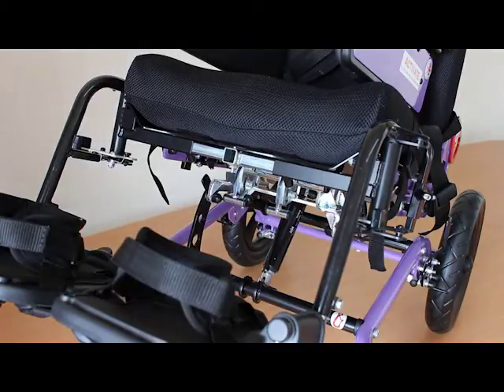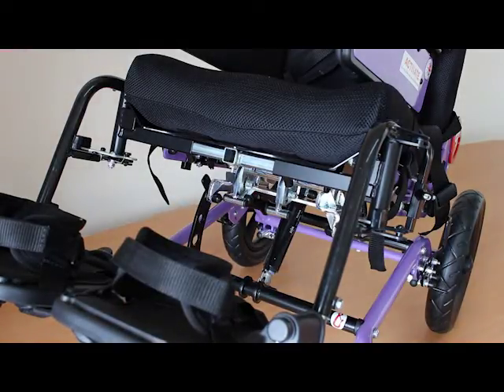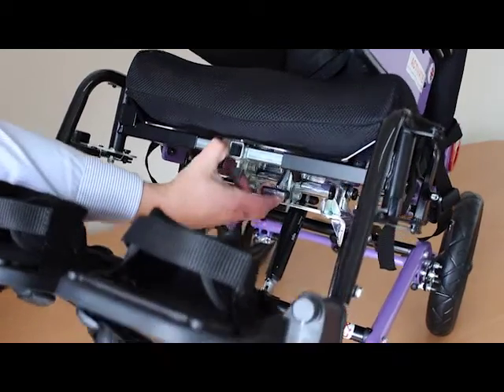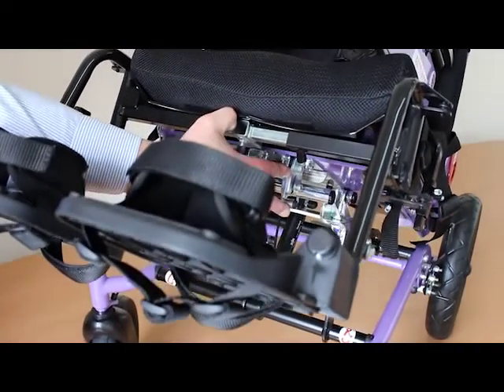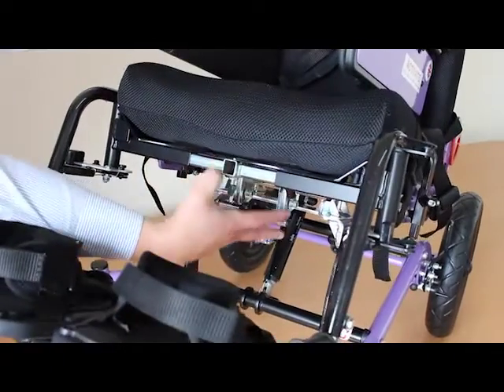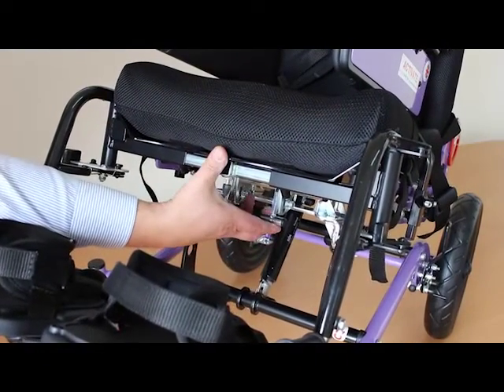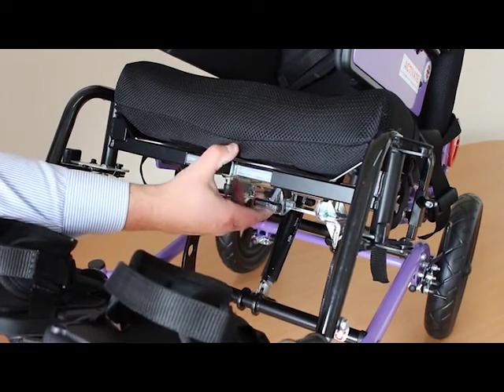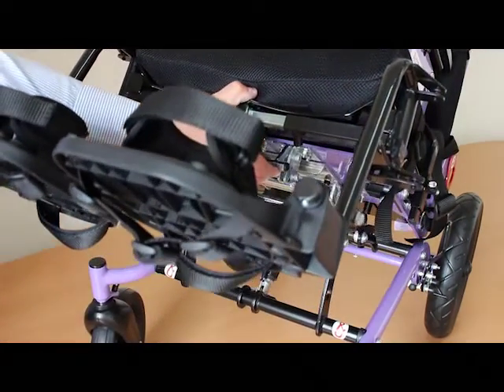To remove the seat unit on the Corgi Sprint, these two catches under the seat must be released at the same time. It's important that both are engaged when clicking back on — this is a safety feature to ensure one isn't accidentally triggered, causing the seat to tip back.